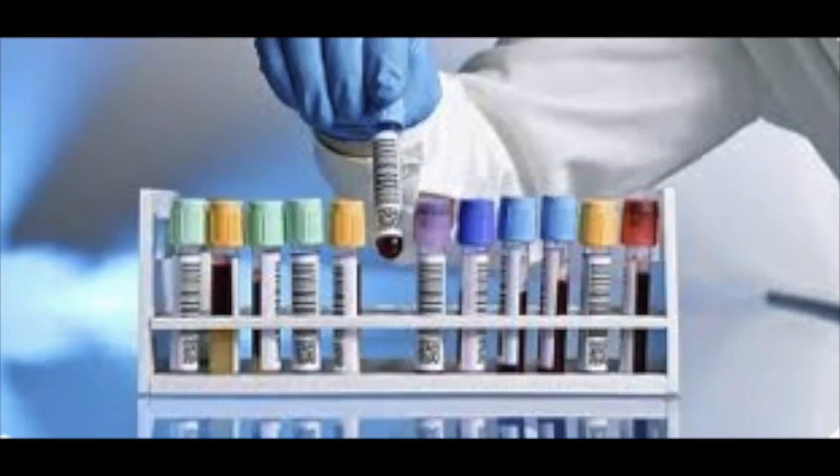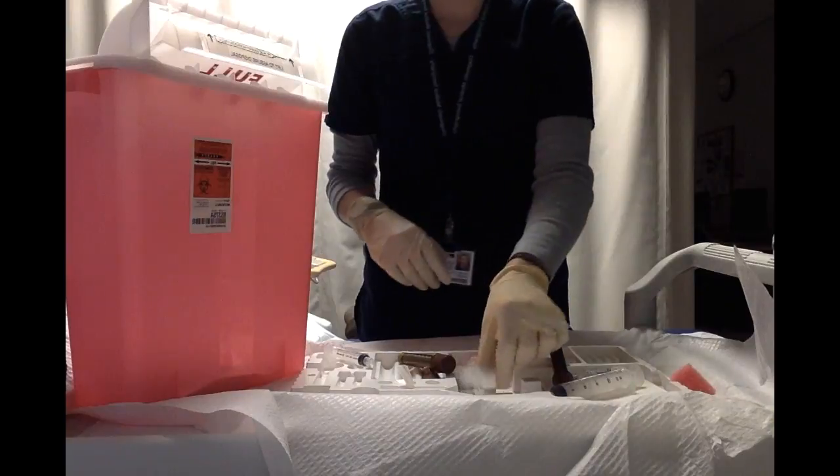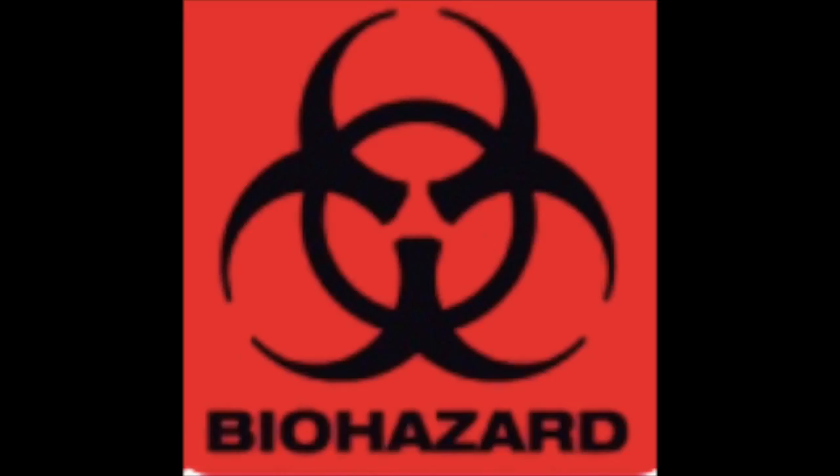At the end of the procedure, collected samples should be appropriately labeled with the patient's information and sent to the lab. All sharps and glass should be carefully and properly disposed of into the sharps container. All other equipment may be thrown into the trash or into the red containers.